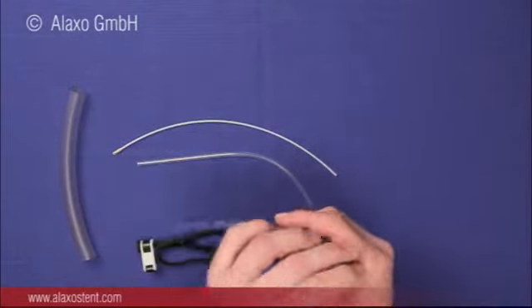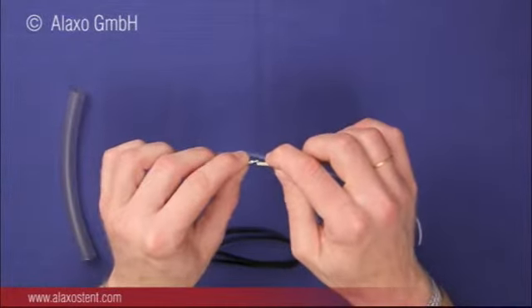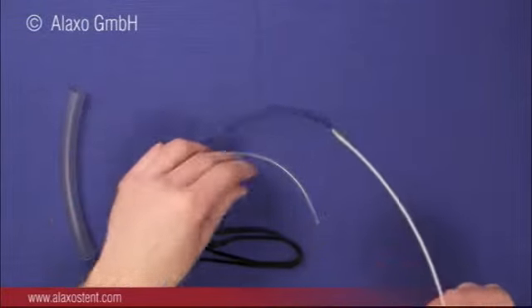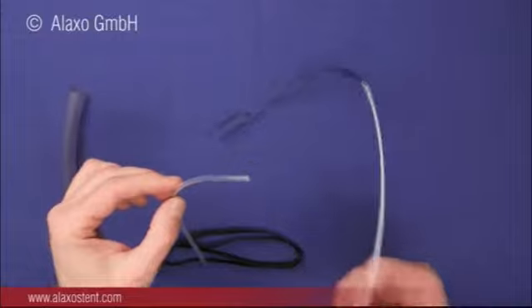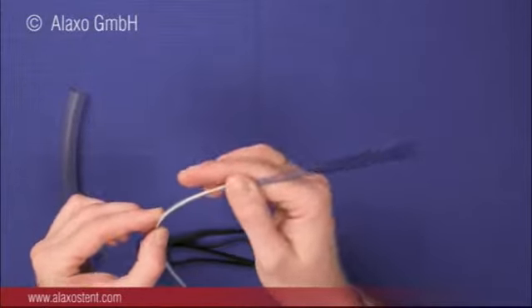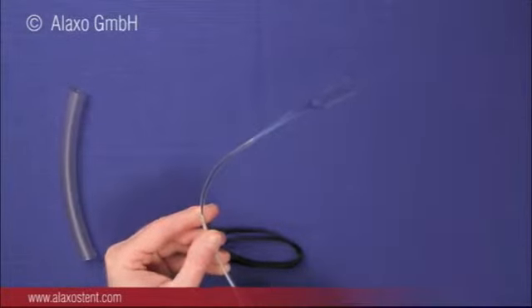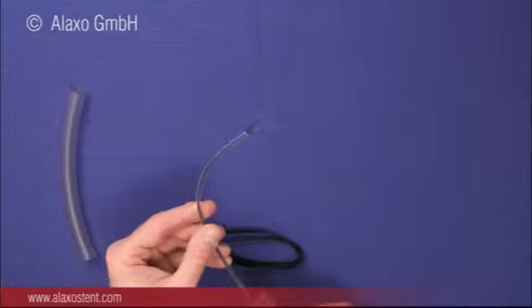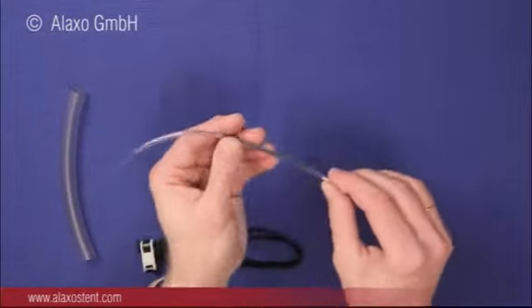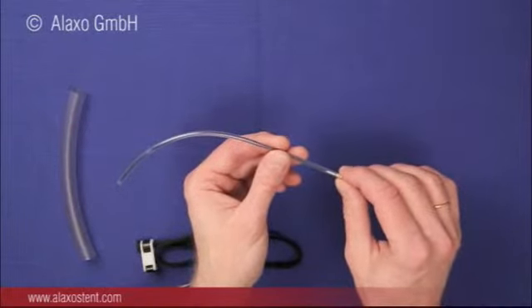For introduction, the stent is connected to the pusher by the clip lock, and then the other end of the pusher is fully inserted into the curved end of the introduction tube. Then, using the pusher, the stent is fully pulled into the introduction tube so that it is completely compressed. The introduction tube then is advanced through the nasal passage into the throat.